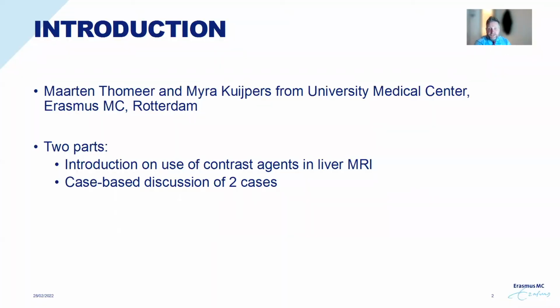I will present this session together with Mira Kuipers, a very promising third-year resident with abdominal differentiation at the department. I will first give an introduction on the use of contrast agents in liver MRI. This will be followed by a new kind of case-based discussion where we want to copy daily supervision as much as possible. Mira will go through 2 new cases, and I will answer all of her questions as far as possible, of course, and I will give her feedback. I hope you will like this new form of case-based supervised webinar.